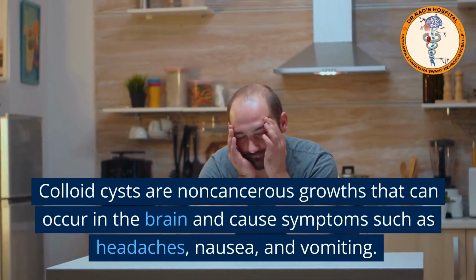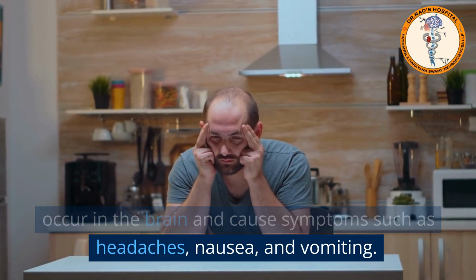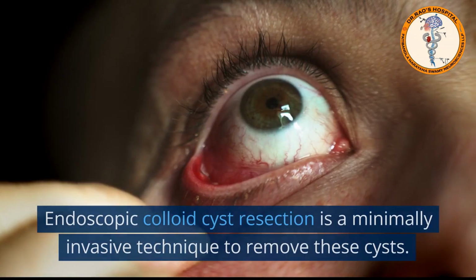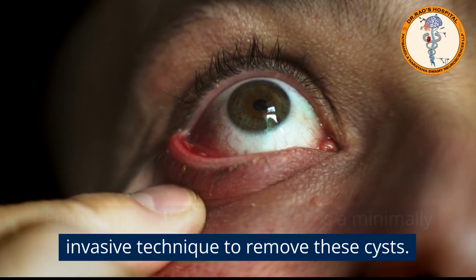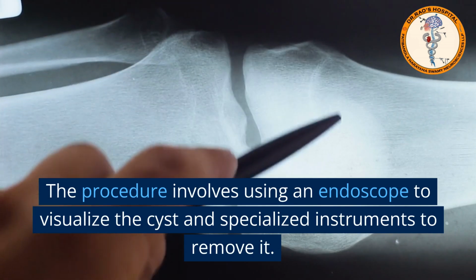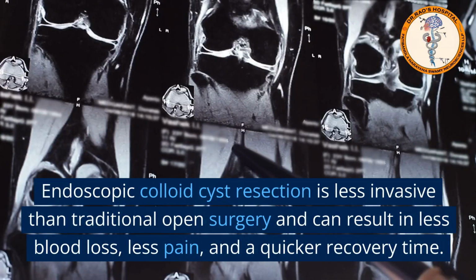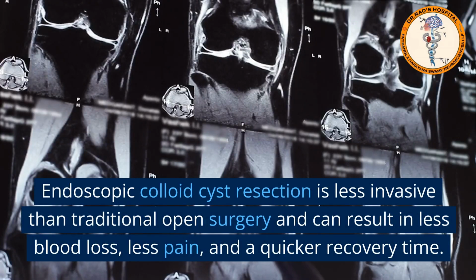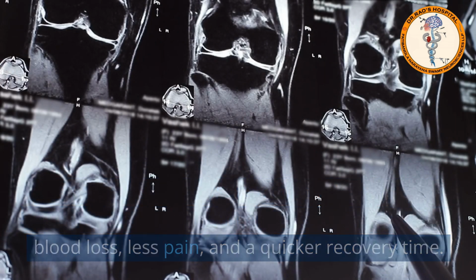Endoscopic colloid cyst resection. Colloid cysts are non-cancerous growths that can occur in the brain and cause symptoms such as headaches, nausea, and vomiting. Endoscopic colloid cyst resection is a minimally invasive technique to remove these cysts. The procedure involves using an endoscope to visualize the cyst and specialized instruments to remove it. It is less invasive than traditional open surgery and can result in less blood loss, less pain, and a quicker recovery time.